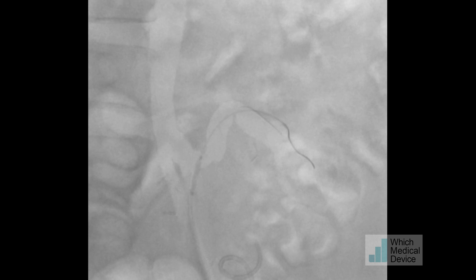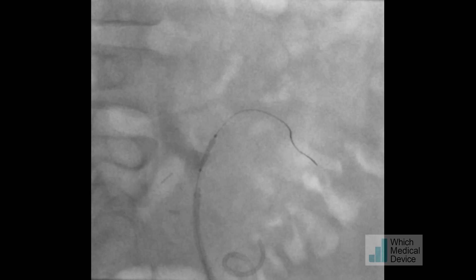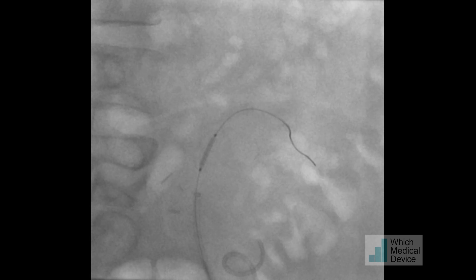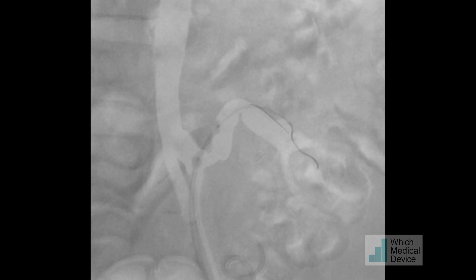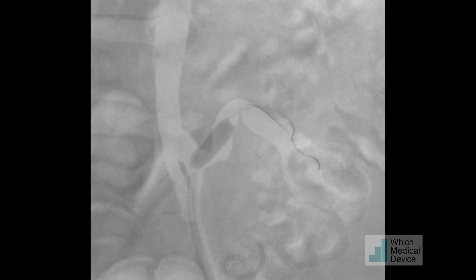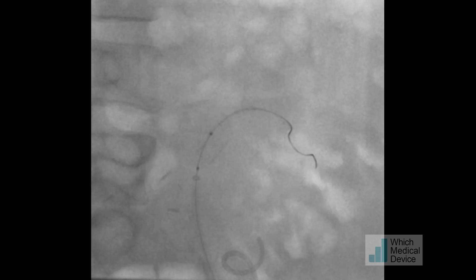I've now got a 7mm by 12mm Terumo Tsunami stent, which is balloon expandable. I would ideally have liked an 8mm one but we didn't have any on the shelf — 7mm should be sufficient, and I'm going to slightly over-expand this. Confirming position again, I'll keep slight forward pressure on the stent as I slowly inflate the balloon to 14 atmospheres. This will dilate it to over 7mm, perhaps to about 7.5mm, which is almost ideal for this size of transplant renal artery. Very little waisting at all — the waisting visible was just due to the stent expanding.